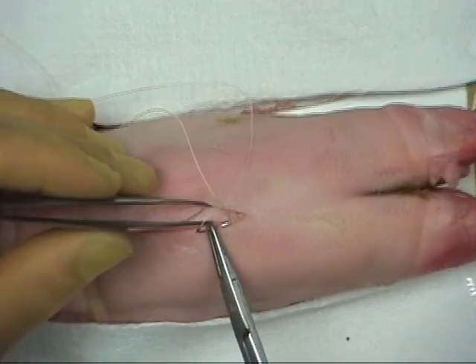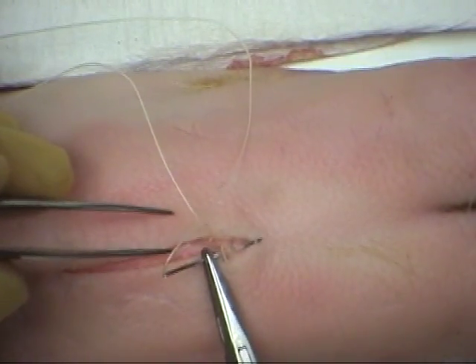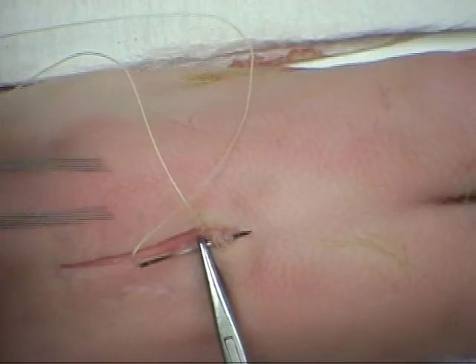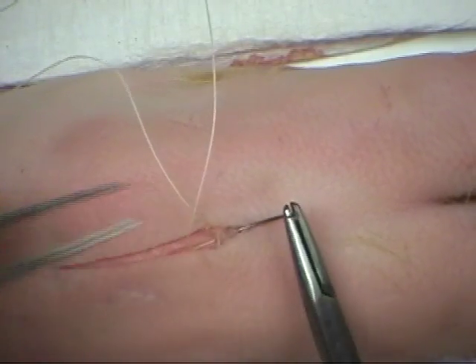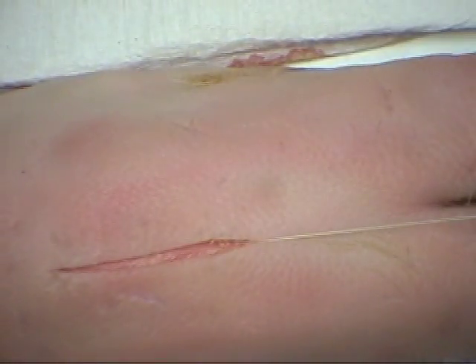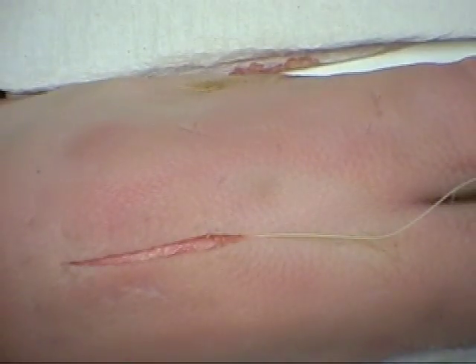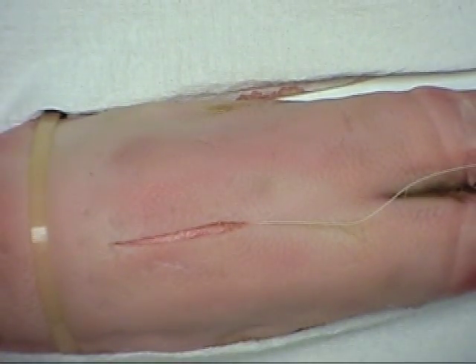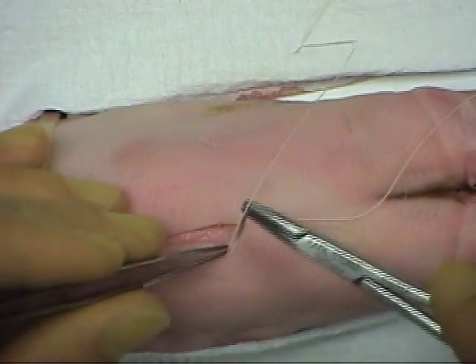Working from the apex, small bites are placed just deep to the dermal layer. The entry point of a bite is placed directly opposite the exit point of the previous bite.